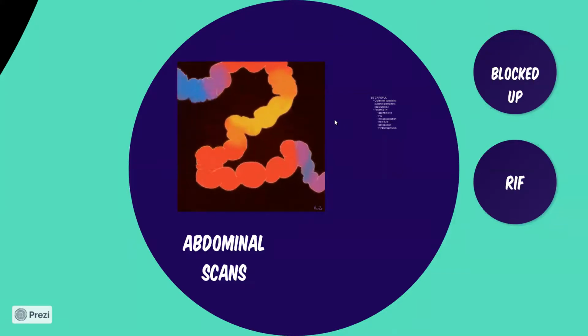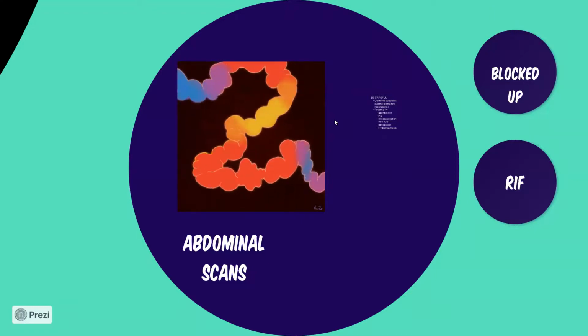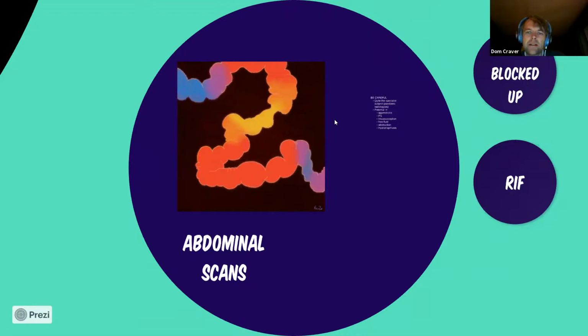Yeah, it's so important, because obviously there are some radiologists who are quite skeptical of these point of care scans, and I think having a good relationship with radiology is really key. And obviously in that kid, if I couldn't see anything else and I thought it was normal, you still wouldn't send them home, because they've got a lot of tummy pain. They're pretty poorly. So you're not always going to find something. Obviously, these are my hits. I've not shown you all my duds.